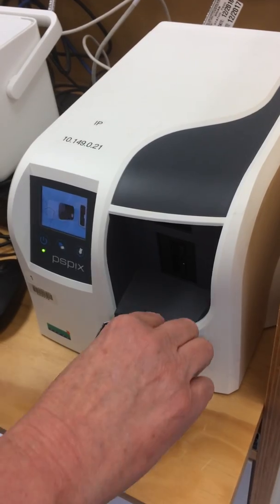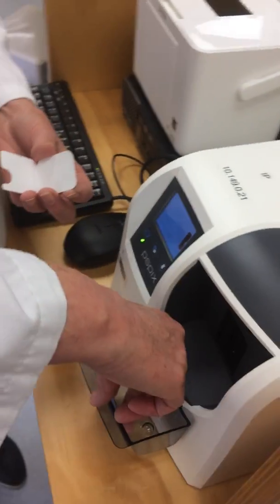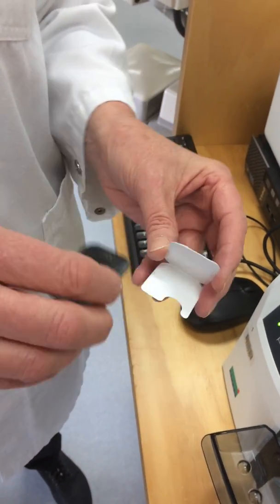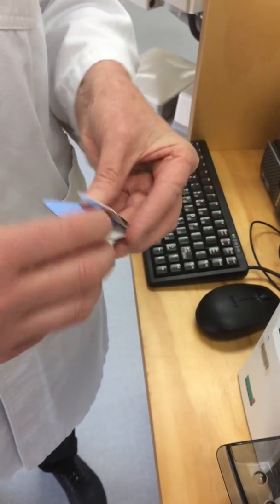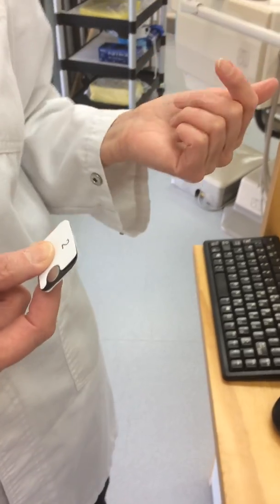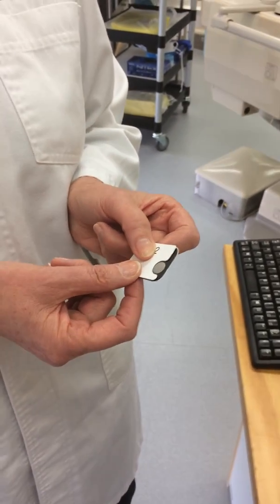Carefully take it out, preferably holding it on the sides of the phosphor plate, and put it back into the cardboard sheet. Take that back to your chair, and then you can start to take other radiographs.